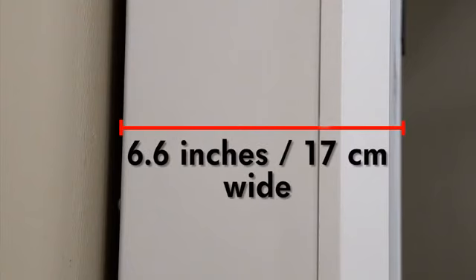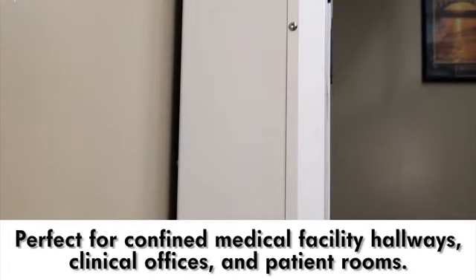The slim 6.6-inch, 17-centimeter profile takes up minimal space when installed in a medical facility hallway, clinical office, or patient room.